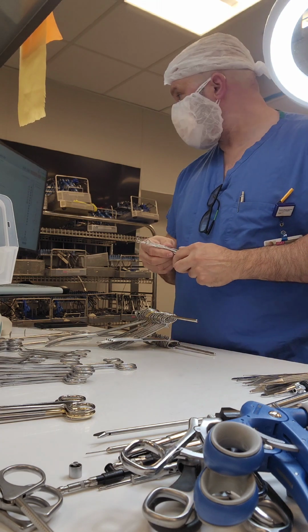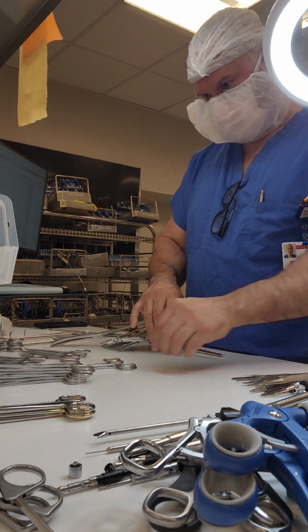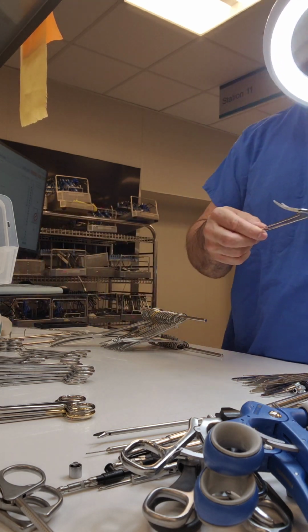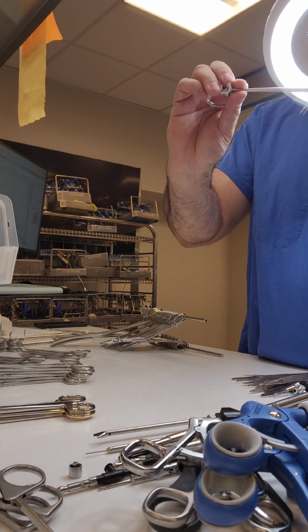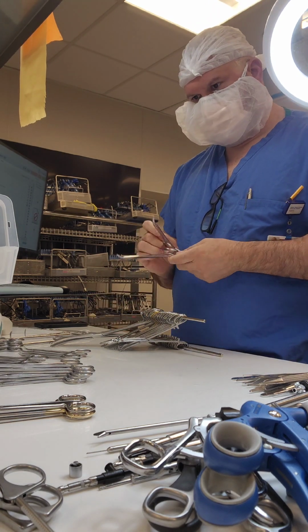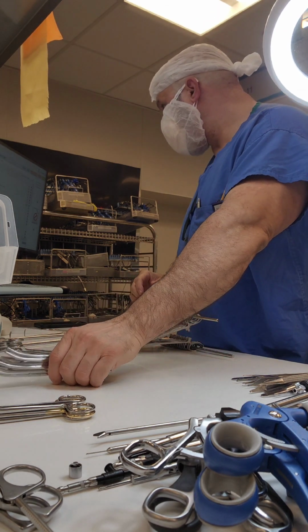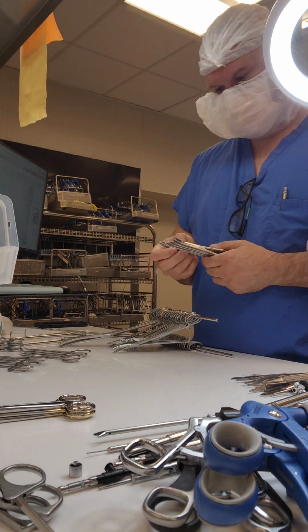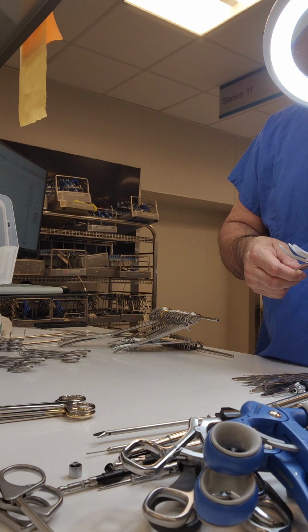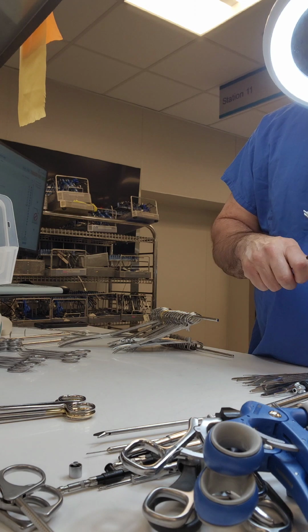Now, this is the basic minimum quality in this set. Now, we do have borescopes, but both of our borescopes were down. So I couldn't use my borescope, so I employed older methods of inspecting for cleanliness of my instrumentation. I also didn't implement any soil testing. So again, think about your processes, okay? What took you 10 minutes, 11 minutes, 12 minutes, 15 minutes to do, the more quality you implement into your sets, more testing every instrument, tap testing every instrument, testing every scissor, insulation testing, soil testing, all that takes time, so it's going to add.